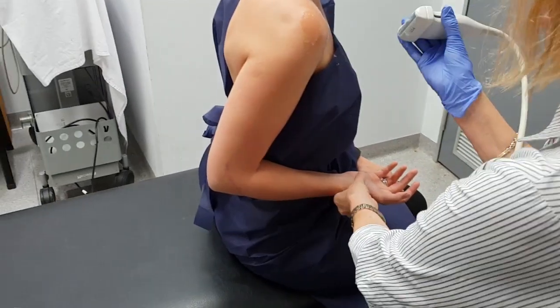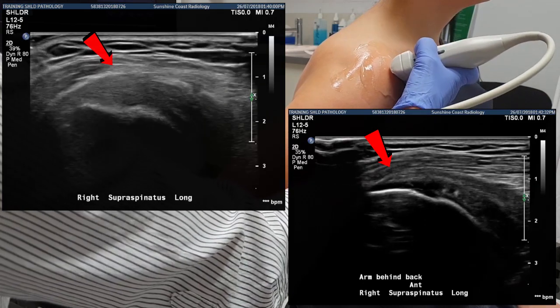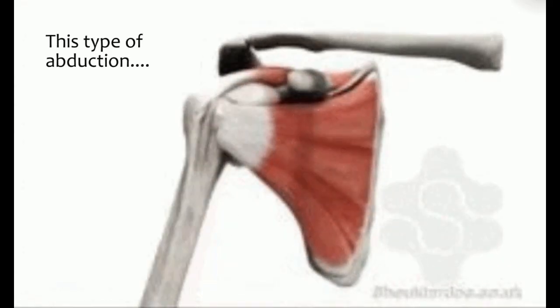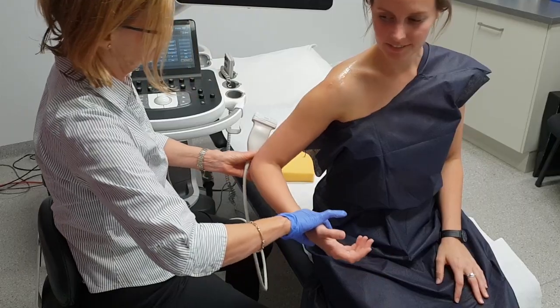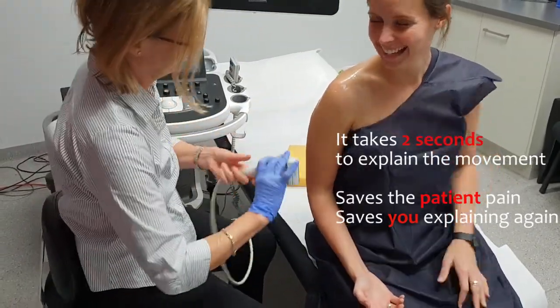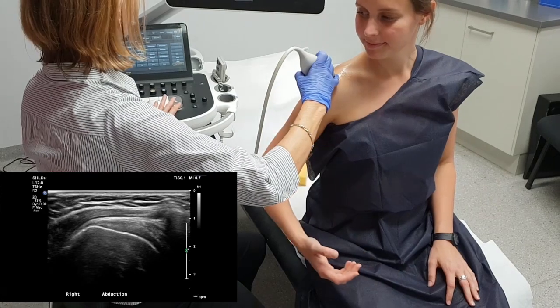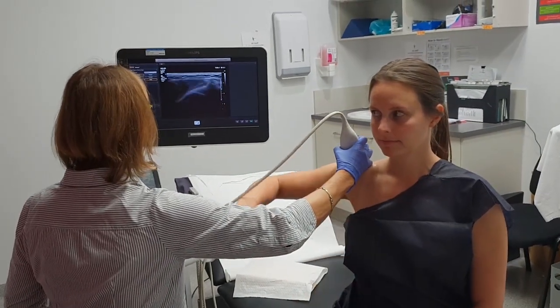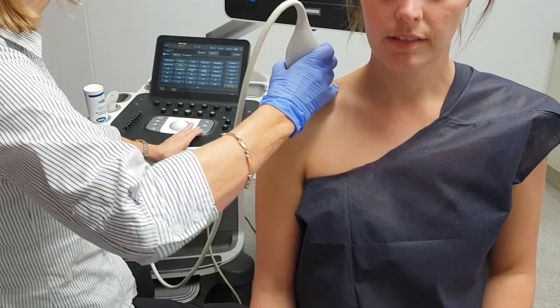By placing the patient's arm behind their back, you will open up the tendon. If there's a tear there, very often you will get fluid coming into the tear, so it will show the tear with a lot more accuracy. I'm going to have a little look at abduction now. In a moment I'm just going to get you to lift your arm out to the side, and if it starts to hurt just let me know. I always get the patient to move their arm backwards a little bit, line the transducer up so I can see the acromion on the edge again, and then I get them to slowly lift their arm up. Then I'll go around and have a look at the AC joint.